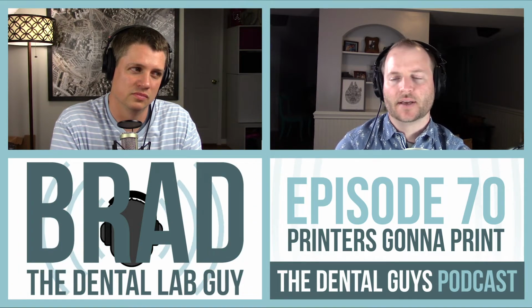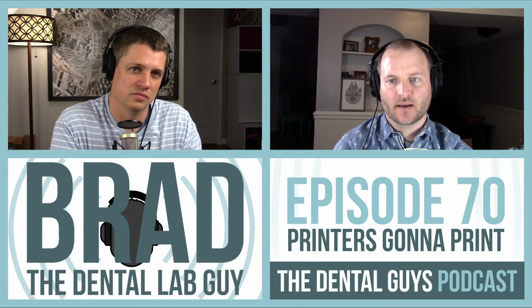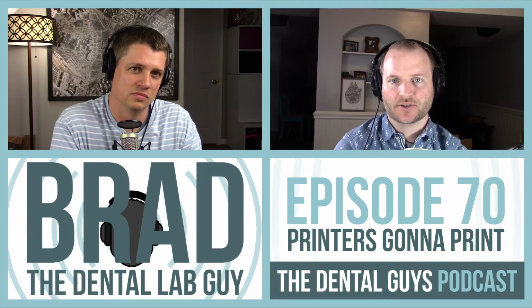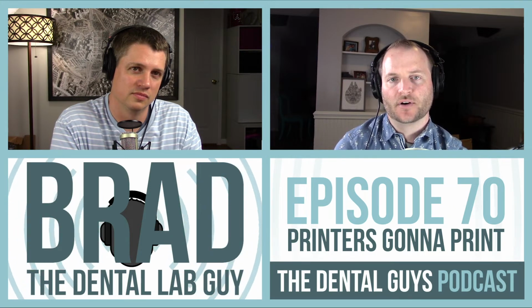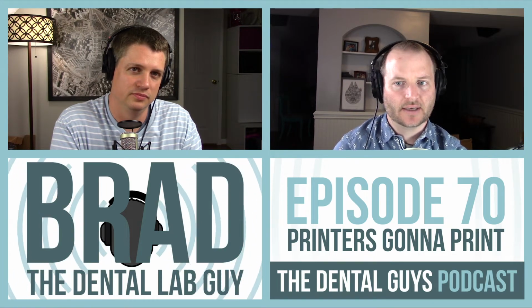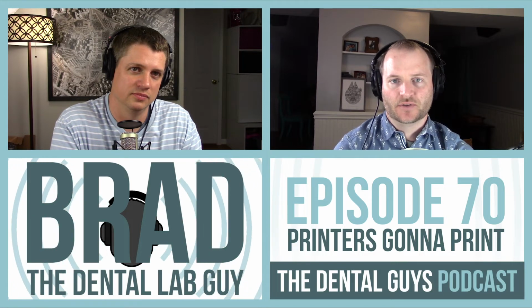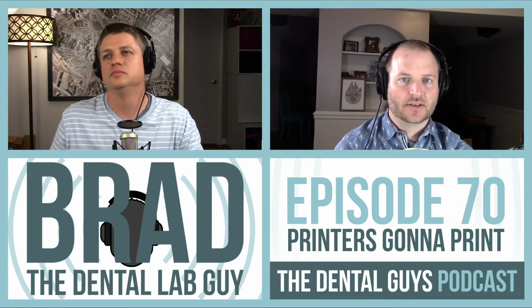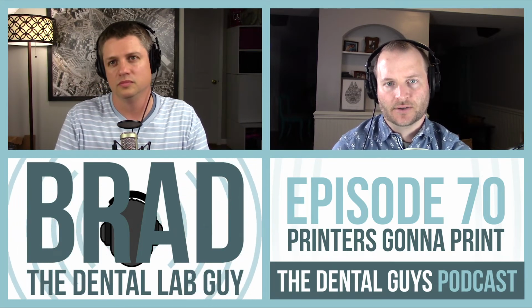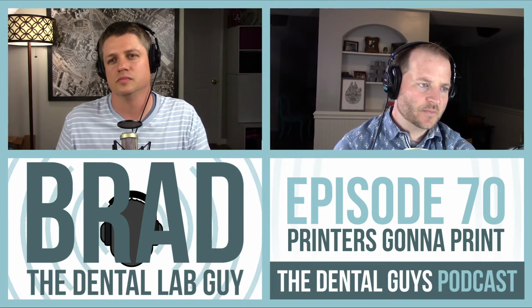Yeah, and I think something like night guards and aligners, again, assuming you want to take the time to do that, are a good application potentially for a tabletop printer as we know it now, because even there your tolerances can be a little bit less and still have a pretty good result. And there's whole businesses built on trying to save money compared to, say, Invisalign by printing your own aligners in your office. And I feel like that's probably pretty predictable.